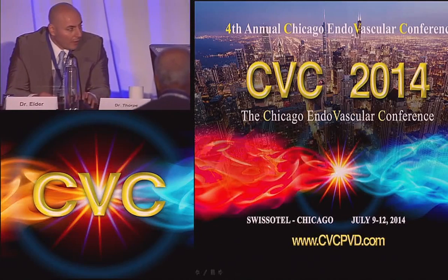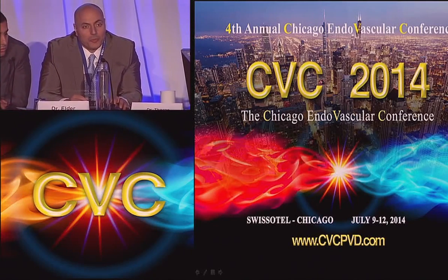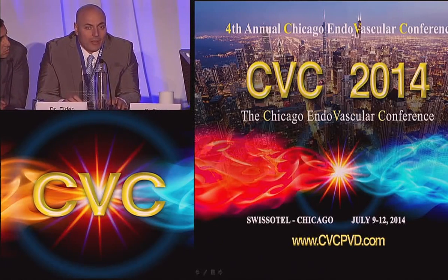Yeah, well, my personal experience is that the whole purpose of using the ECOS is using a small amount of lytic, concentrated.